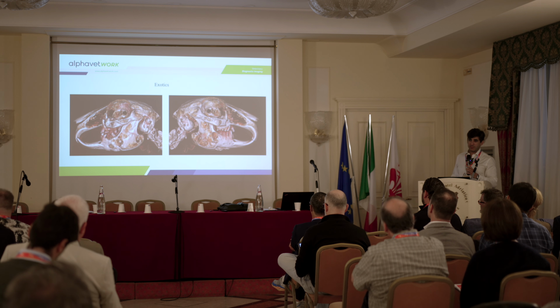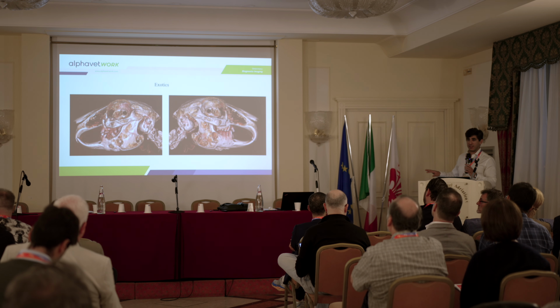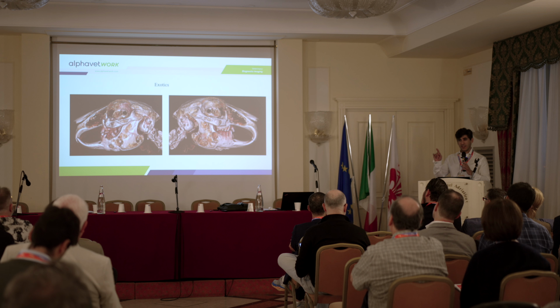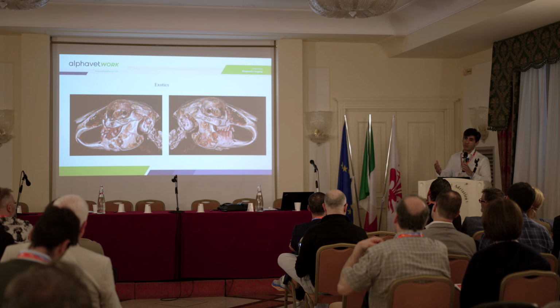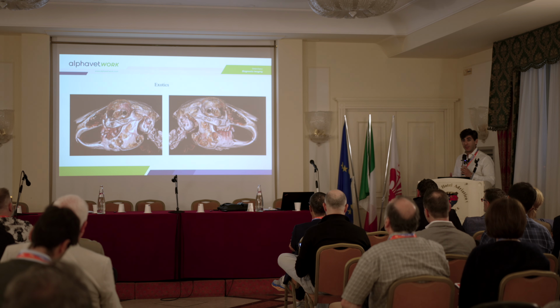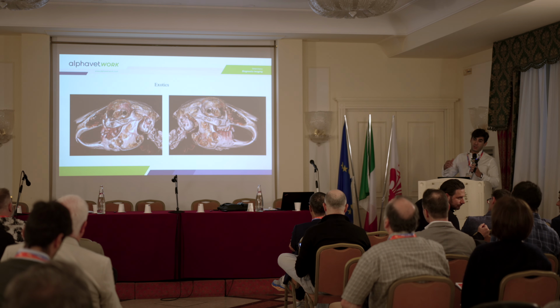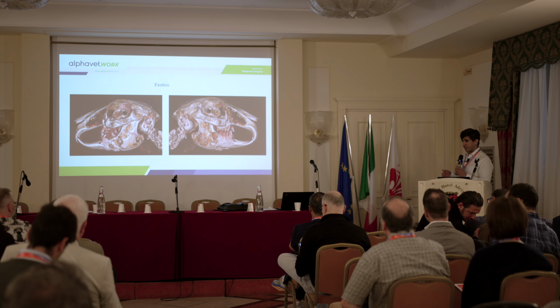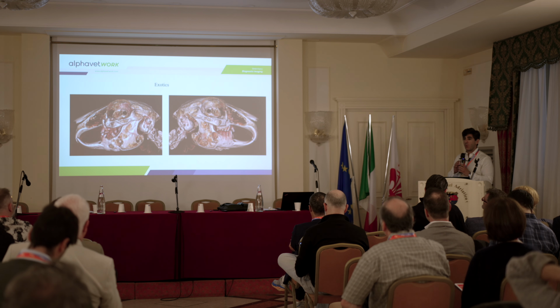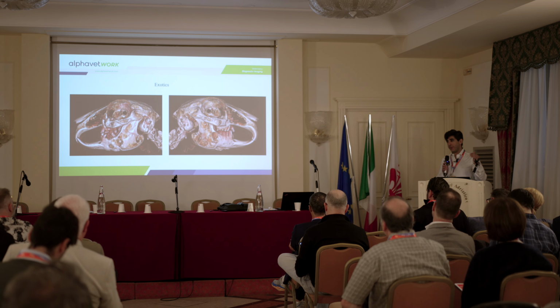For the exotics, I skip the 128 slice CT that I have. I remember a case where I had 3 premolars and 3 molars. Where's the third one in the CT? Then I did the CBCT and said, oh, now where is this? Because I have better resolution. I was missing a tooth in the CT, and I couldn't depict it. And I stressed my applications to work in filter back projection, in iterative reconstruction, nothing. I couldn't do it. So when I do exotics, I go directly to the CBCT.